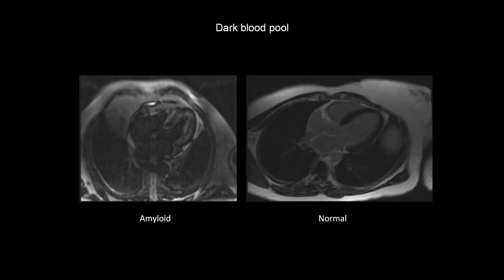One other characteristic feature seen with cardiac amyloidosis on late gadolinium enhancement imaging is a dark blood pool. In most patients, when we undertake late gadolinium enhancement imaging, the myocardium is very dark but the blood pool is generally relatively bright — this is a normal patient with a relatively bright blood pool. But with cardiac amyloid, we see diffuse deposition of amyloid in the myocardium and a notably dark blood pool.